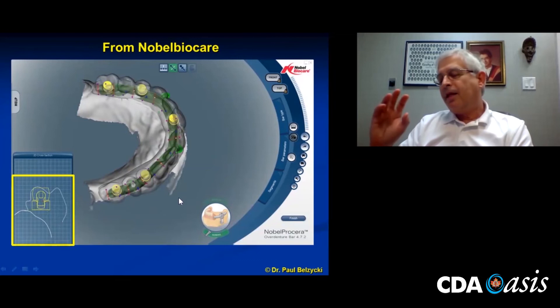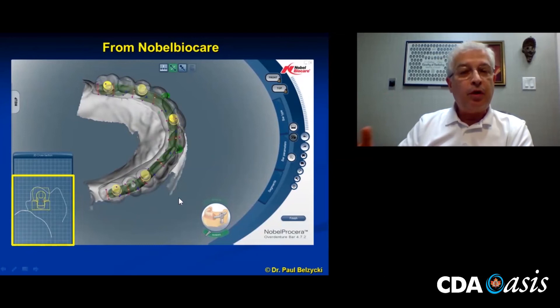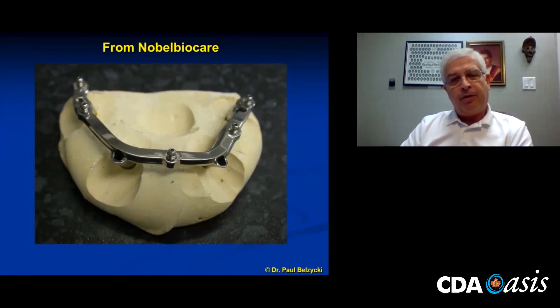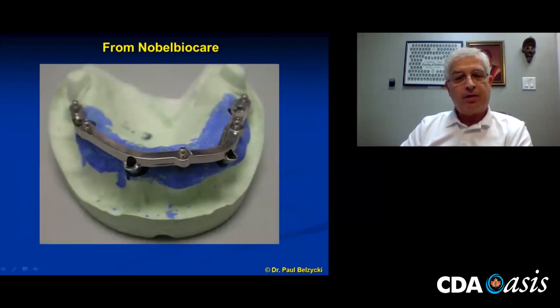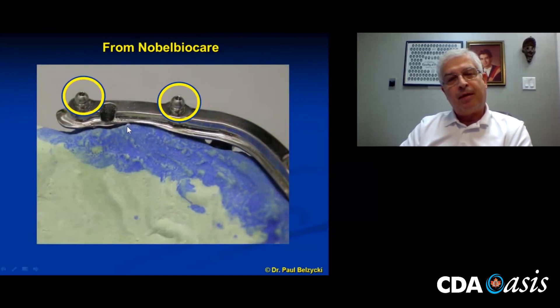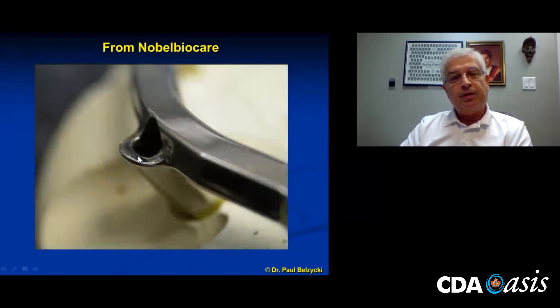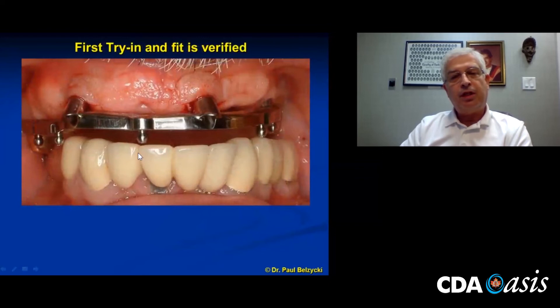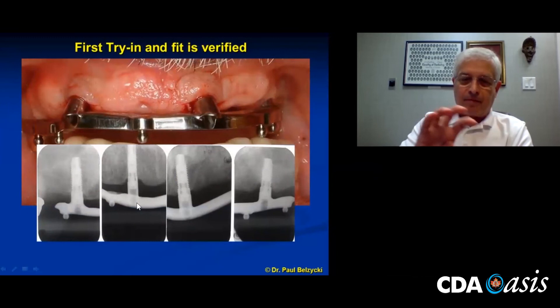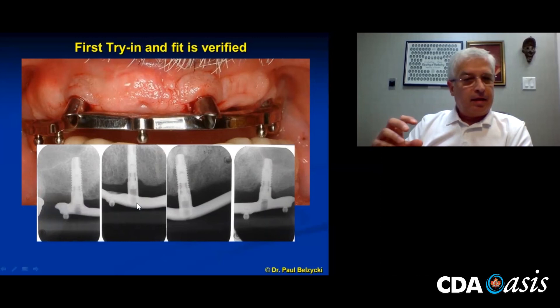We got this back from Nobel BioCare — the model that resulted from the verification jig. It went back on the master model quite nicely. I looked at this and thought, this is what they designed. These areas look a little off — and there are the overdenture snaps. I thought, this looks like it's sticking out into space. How is that going to impact the position of those teeth? The day of trying it in, it just fit absolutely beautifully. This was my first extensive wraparound prosthesis milled by CAD/CAM, and I was blown away that the arch just fit spot on.